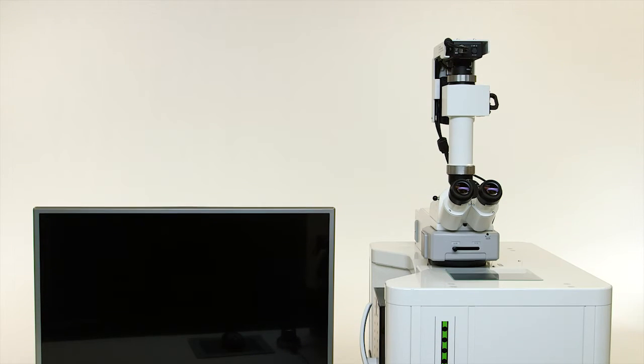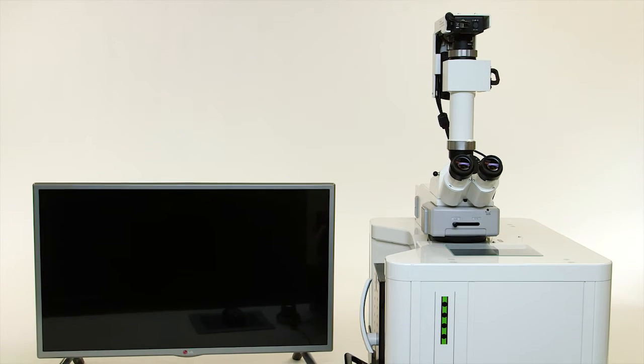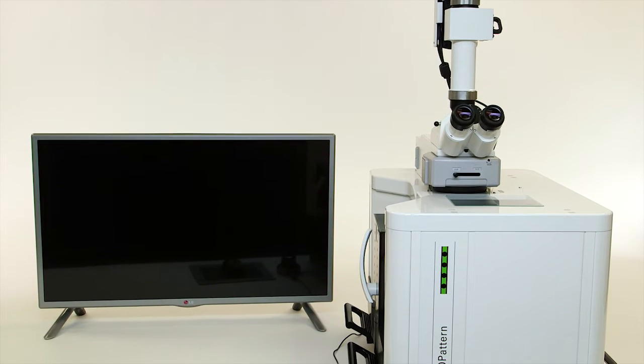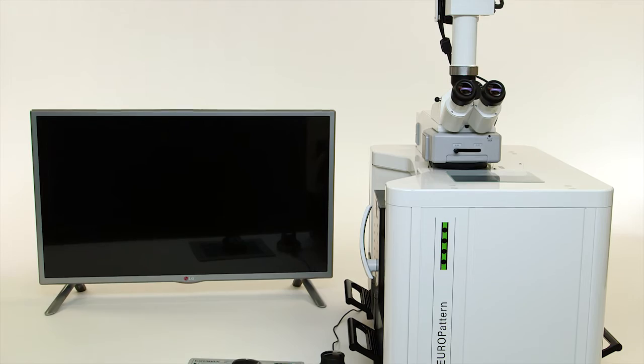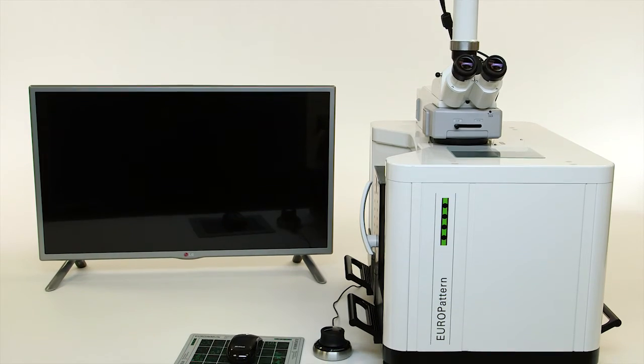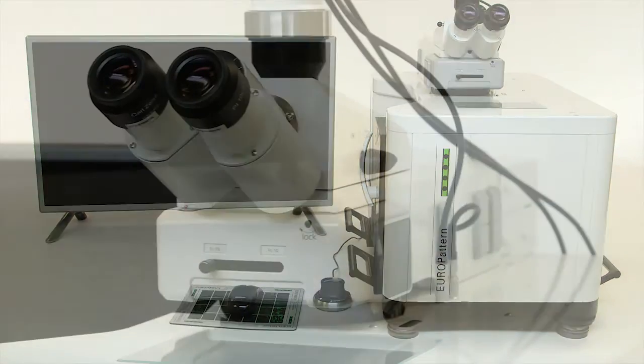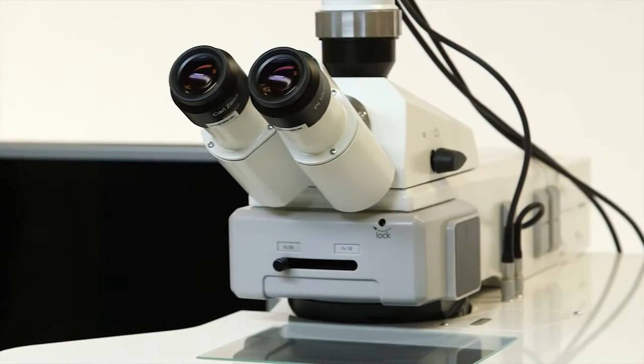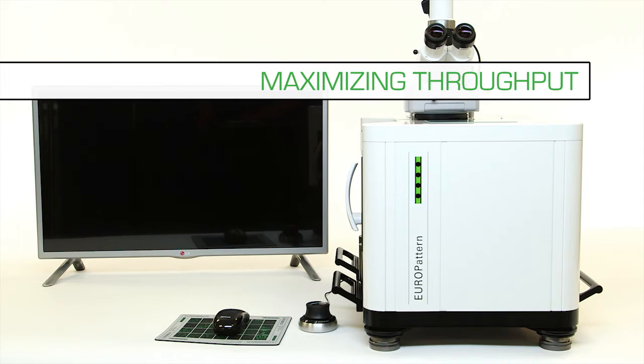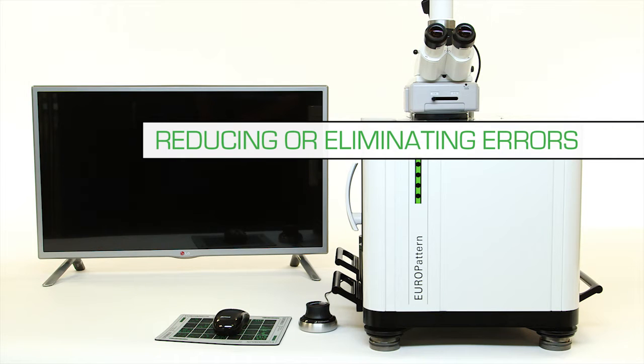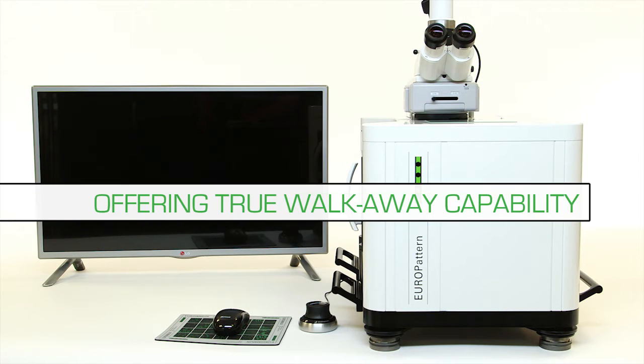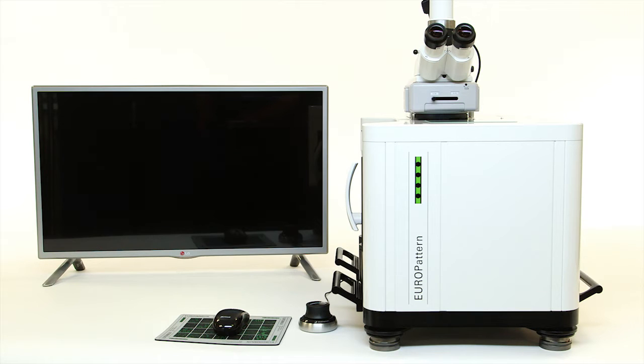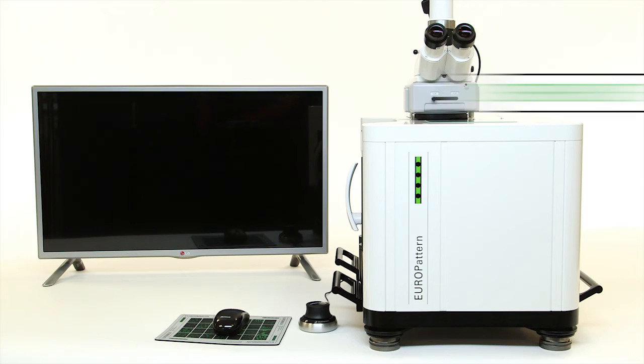The Europatterns Suite 1.5 is a state-of-the-art computer-aided immunofluorescence microscopy system that is redefining the IFA workspace and improving efficiency in the laboratory by maximizing throughput, reducing or eliminating errors, offering true walk-away capability and shortening turnaround time.